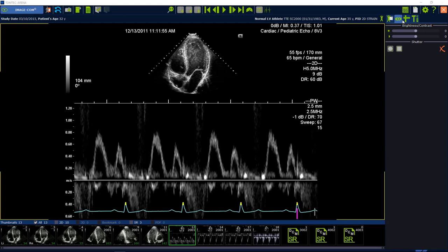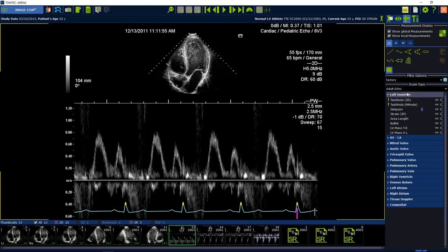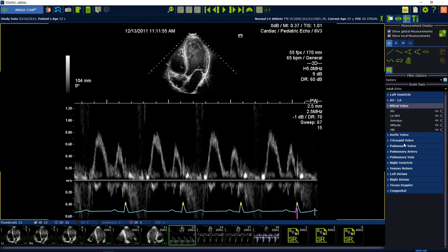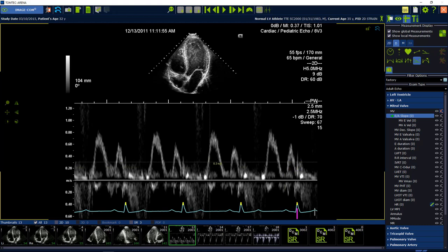Select the measurement tab on the top, followed by the exam type ECHO. Continue with the mitral valve package and choose MV. Select the measurement EA slope.